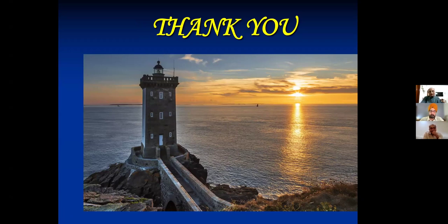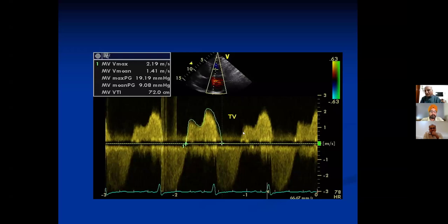Yeah, we always measure it, as you see, the tricuspid area is usually larger than that, but we normally still measure with pressure half-time as we do for the mitral valve also, and that is less than one. When the mean gradient is increased, the area is much less also. So 3D may help you in measuring tricuspid valve area. Many studies have been done on the tricuspid valve itself. But at your level, it will mostly again be a Doppler-based technique.